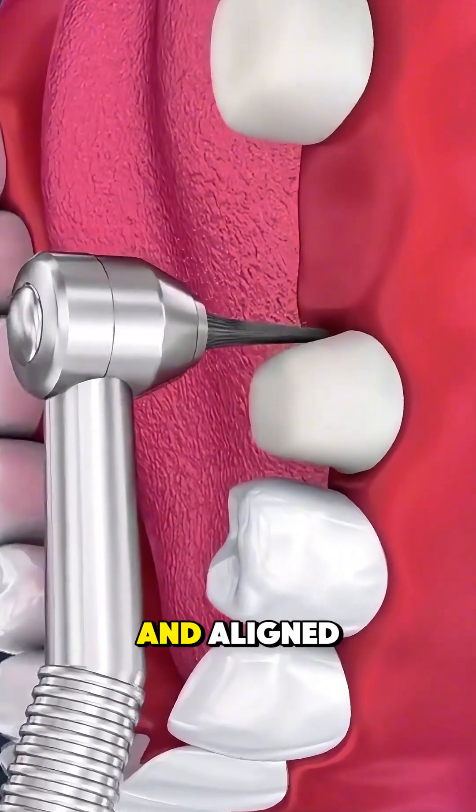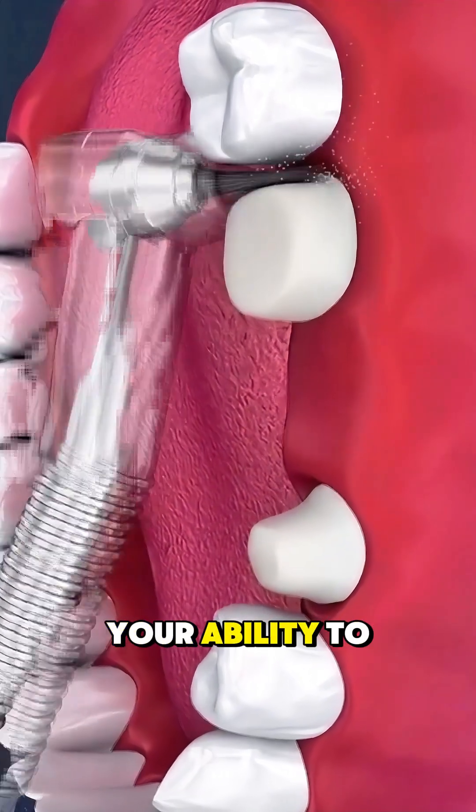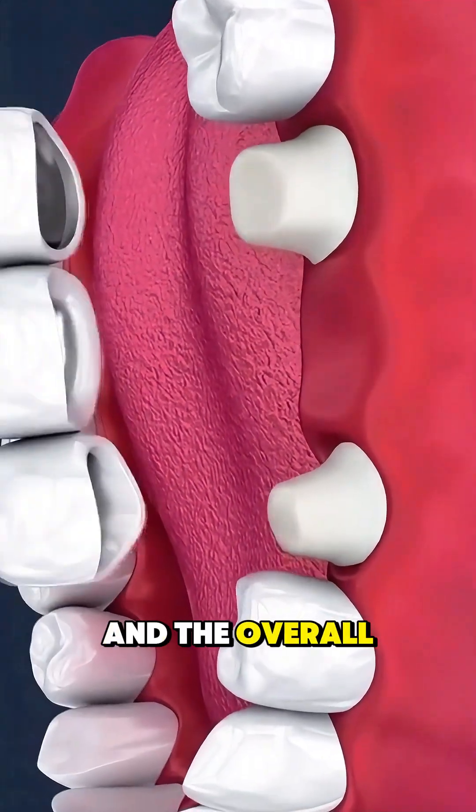With everything polished and aligned, the artificial tooth sits perfectly in the gap, restoring your smile, your ability to chew, and the overall support of your bite.